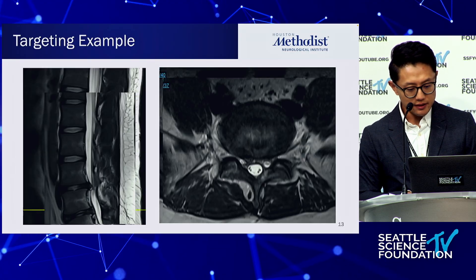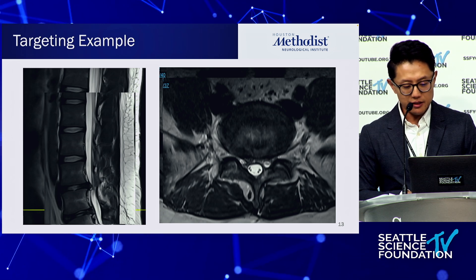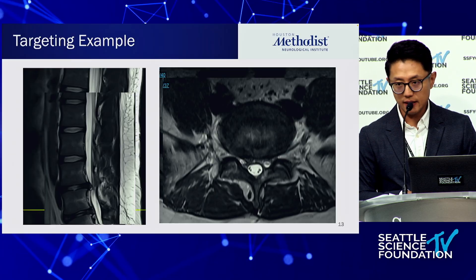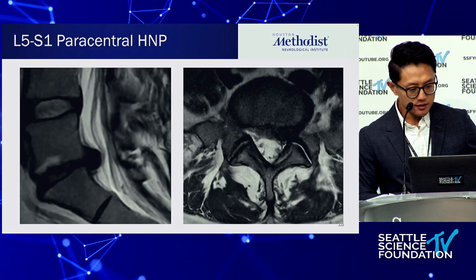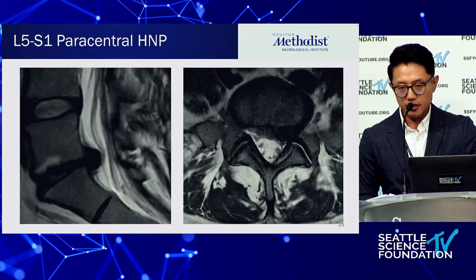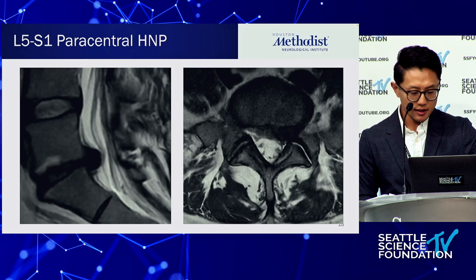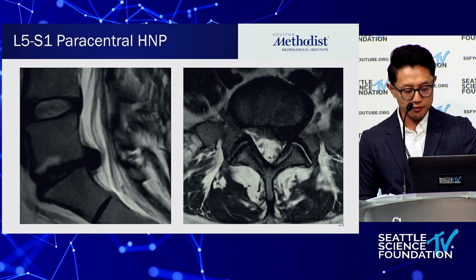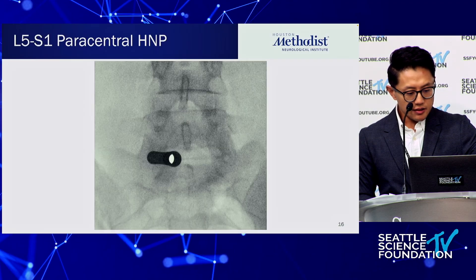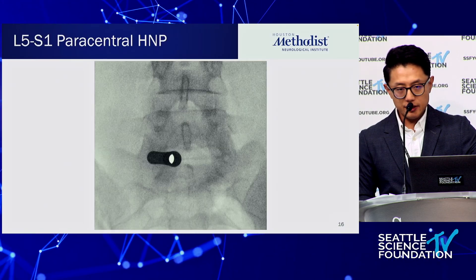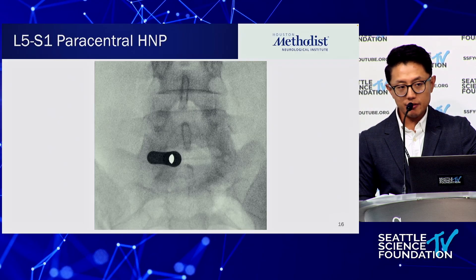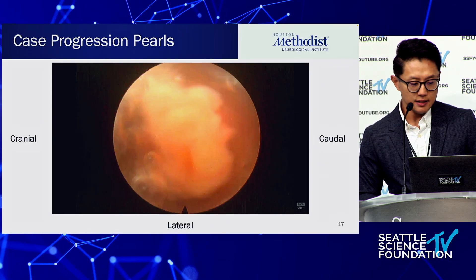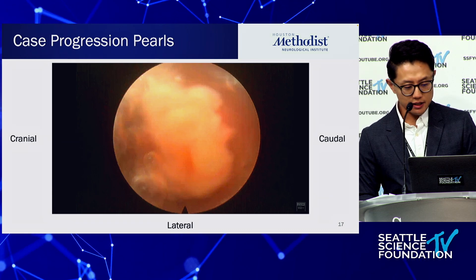Starting medial, you can access the disc herniation and undercut and decompress without really taking any of the facet joint. Here's a case example: L5-S1 paracentral disc herniation with left S1 radiculopathy — this disc is a little more lateral, extending into the proximal foramen. Again, I'm starting medial and looking lateral to leverage the 15-degree scope angle to undercut laterally and minimize bone resection.